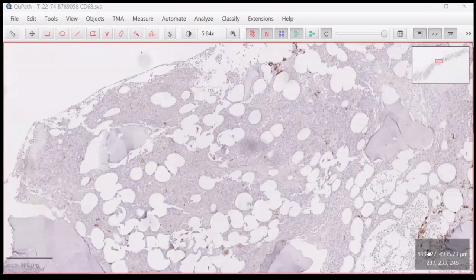Okay, Doctor. So CD117 should be regarded as positive if it's cytoplasmic staining, regardless of the intensity, right? Yes. And as you mentioned, it can be seen in regenerating areas. So that is another reason why we should do E-cadherin and glycophorin to show that this is actually regenerating marrow. Yes. On that note, can I ask whether we should have done TdT and PAX5 on this case for hematogones? Yes. Okay. Definitely. Definitely.